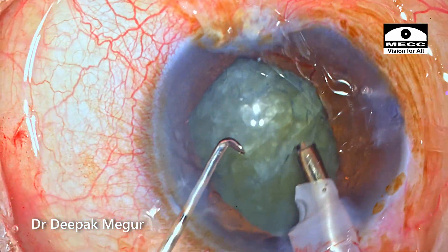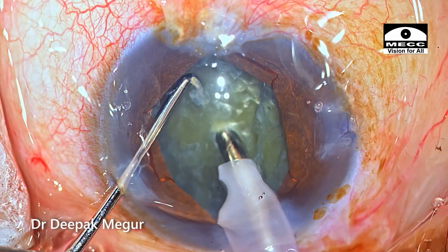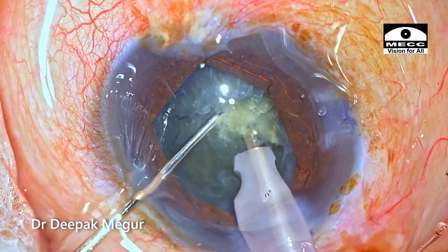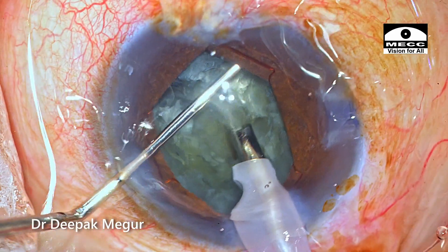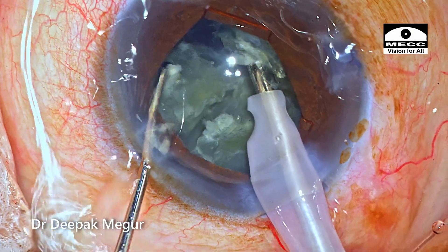Time to emulsify the nucleus. The tip is buried into the core of the nucleus and using a sharp chopper, a vertical chop is used to create the first chop. Subsequently, the nucleus is divided into multiple smaller fragments, and then each of these fragments is emulsified in a controlled manner.